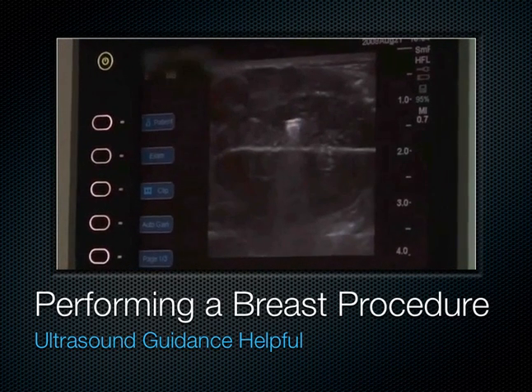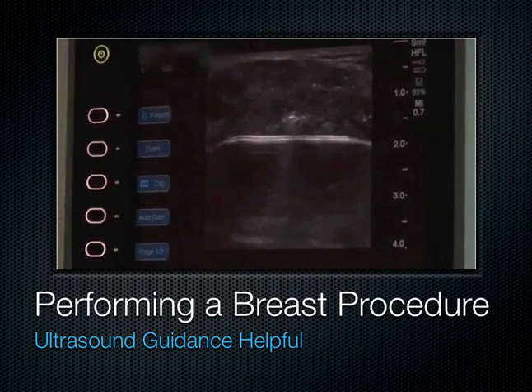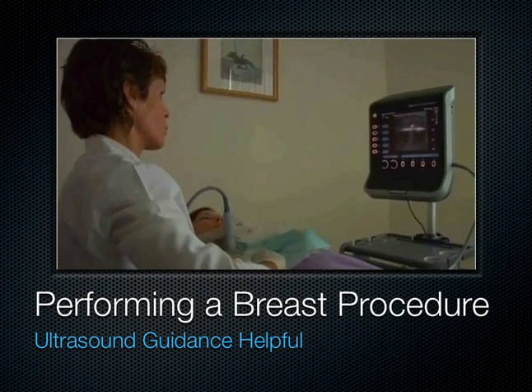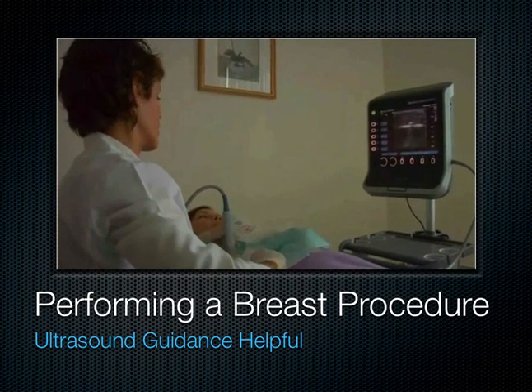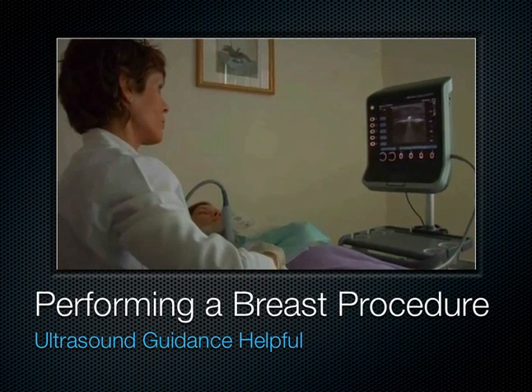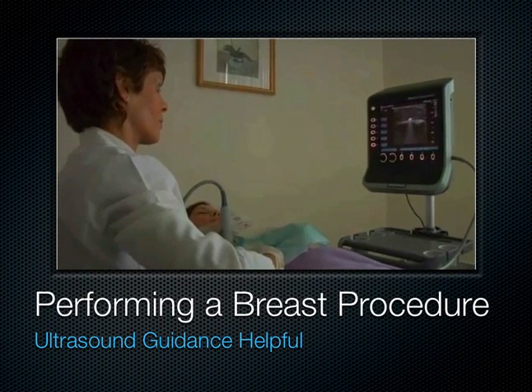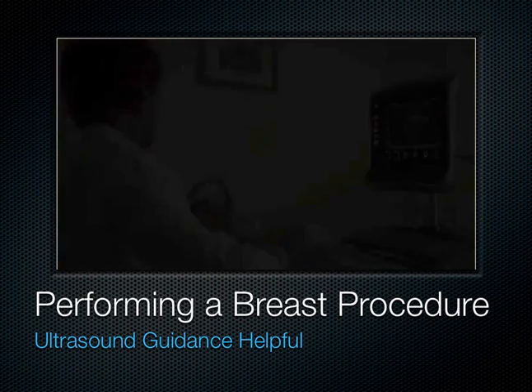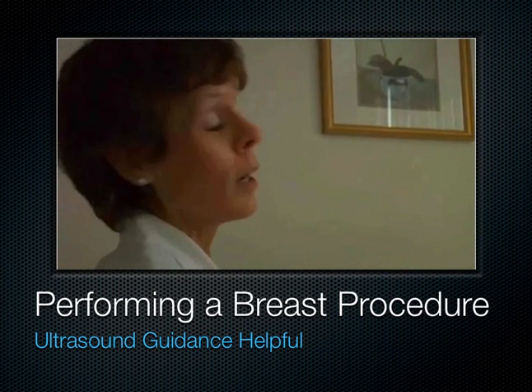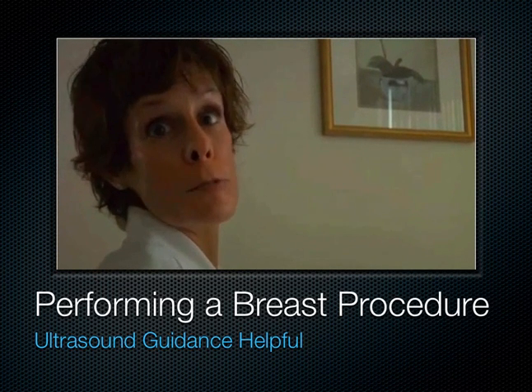So what you'll see if you're watching on the screen, you see the probe there, and you see it starting to get black behind it. That's because the ultrasound waves can't go through the ice. You'll see that double white line get higher and higher, and that's just as it's starting to engulf the whole thing. It sort of eclipses it. As you can see, you have to have the probe centered directly in the middle of the lesion. This is not something you can just do by palpation or just by feel.